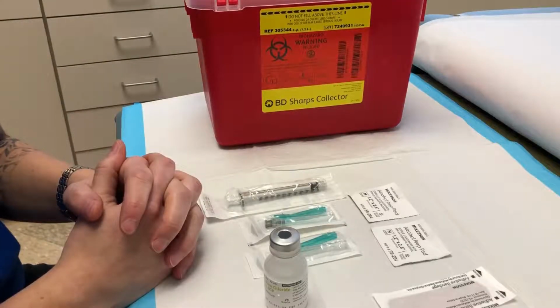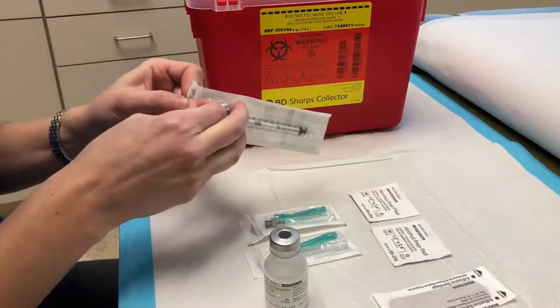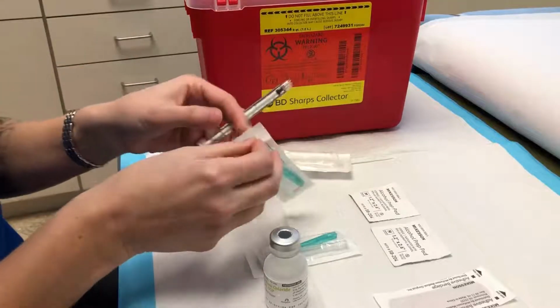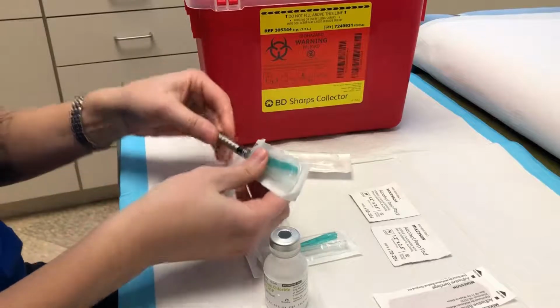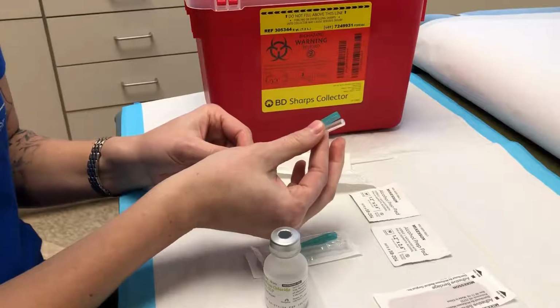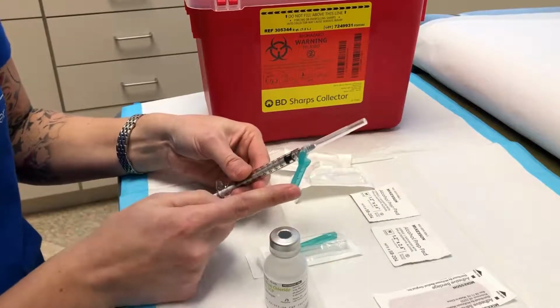First, you're going to prepare your syringe for drawing up your medication. When you twist on your needles, try not to touch the tips of the supplies to keep everything clean. A 22 gauge needle is a good size for drawing up your medication. Make sure you twist from the base and not from the top, which is too flimsy and you may accidentally poke yourself. Pull this green safety feature out of the way.